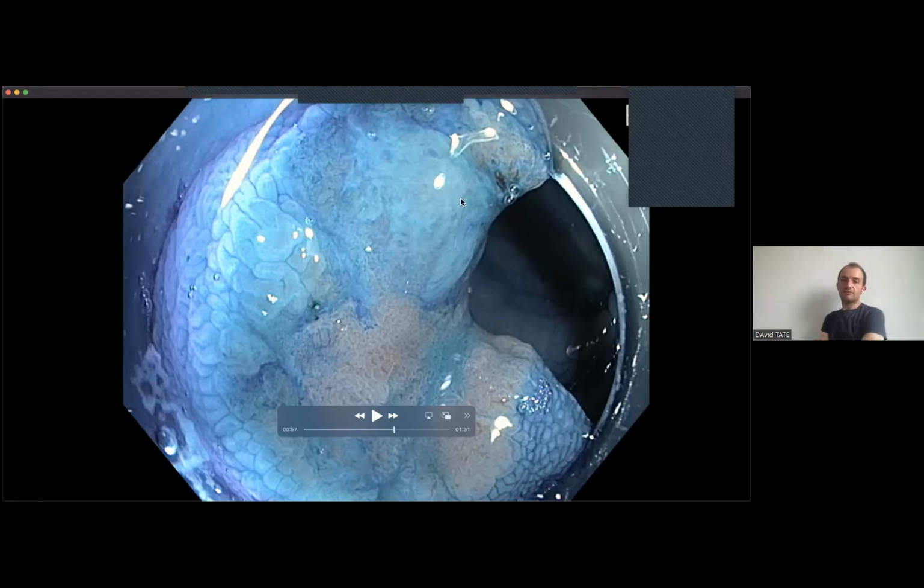So this is a polyp with deep submucosal invasion in it, and therefore we don't need to continue with the algorithm. We can simply say that this is a polyp which has clear evidence of cancer, and the decision making after that is for the next time. But it's certainly something that should be removed endoscopically en bloc or sent to a surgeon.